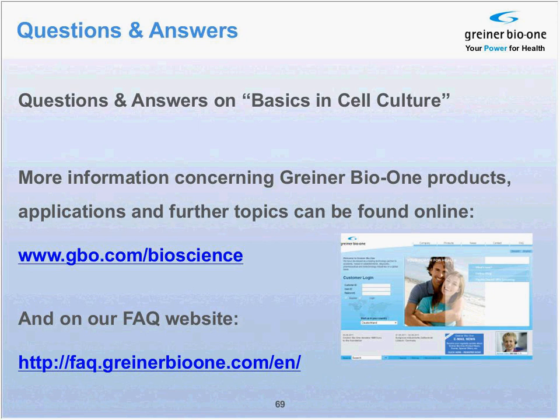I mean, from my position now, it's somewhat hard to tell, of course. I would think of maybe just cell debris that would accumulate during the culture. Another possibility, depending on the cell line you're using, is vesicles released from the cells, or small vesicles derived from membranes.